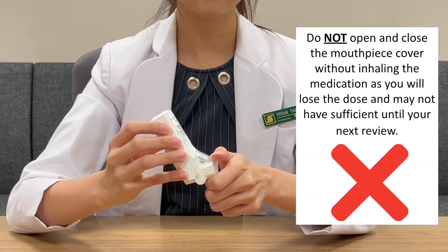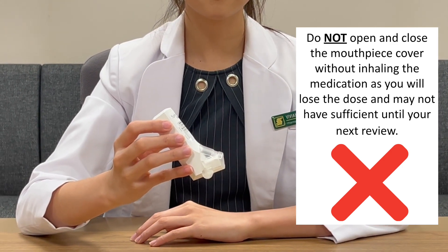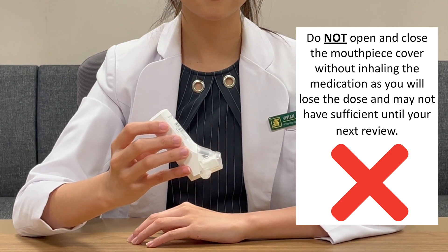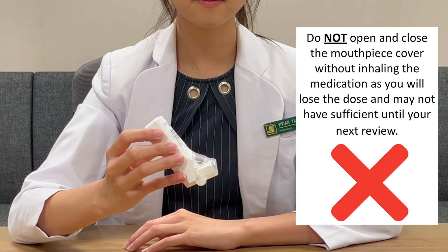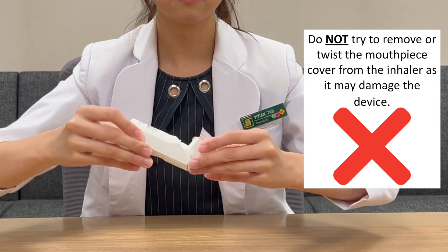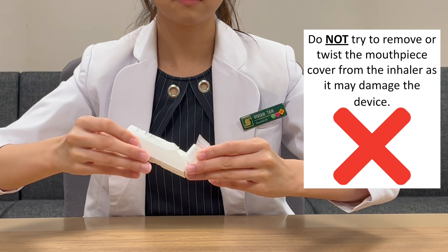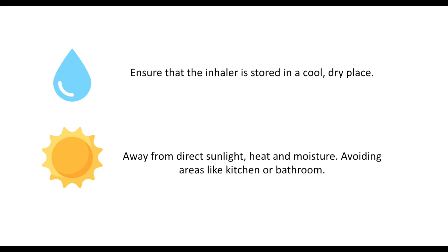Do not open and close the mouthpiece cover without inhaling the medication, as you will lose the dose and may not have sufficient until your next review. Do not try to remove or twist the mouthpiece cover from the inhaler as it may damage the device. Ensure that the inhaler is stored in a cool dry place away from direct sunlight, heat or moisture.